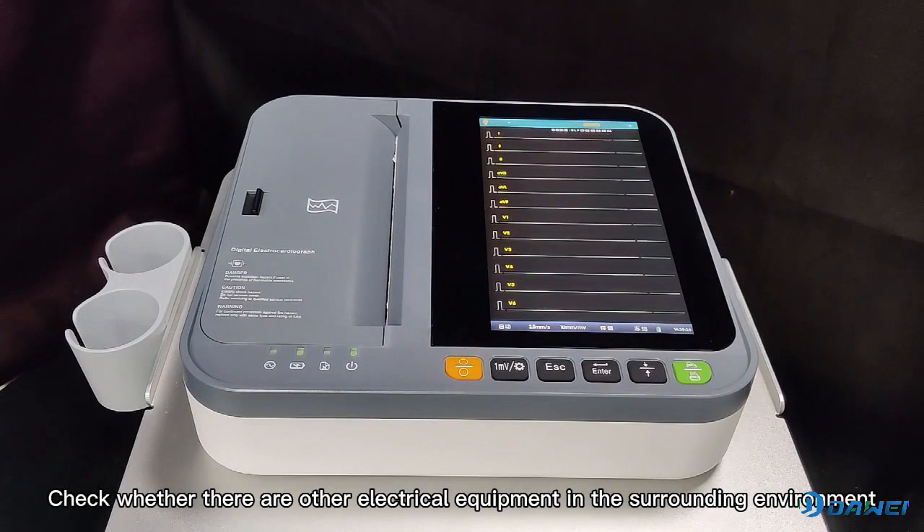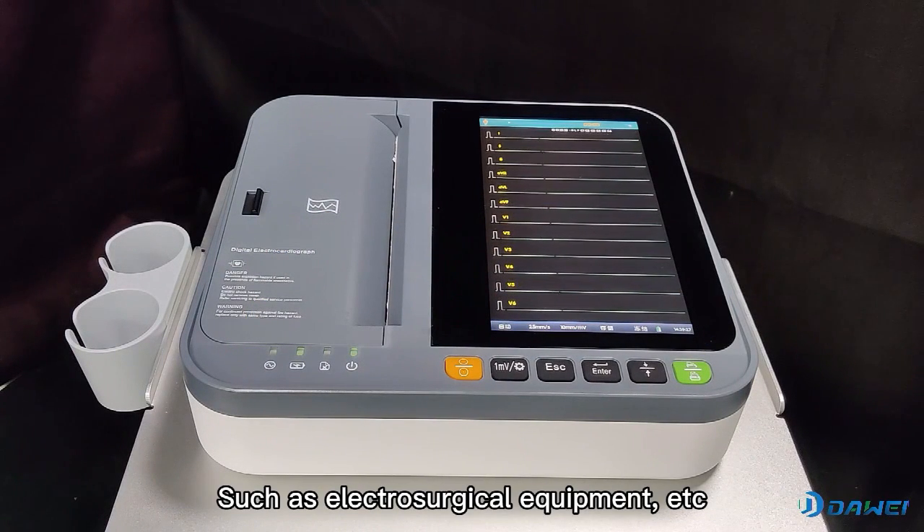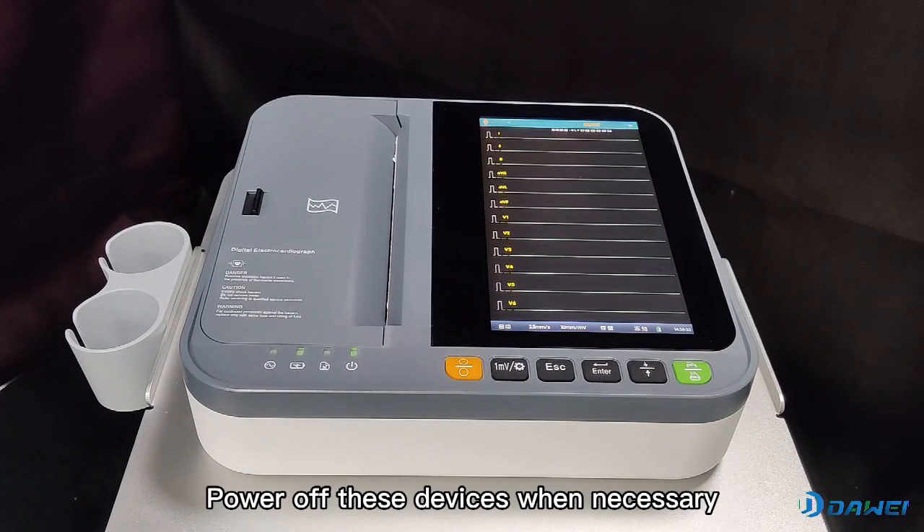Check whether there are other electrical equipment in the surrounding environment, such as electrosurgical equipment, etc. These devices may cause interference. Power off these devices when necessary.